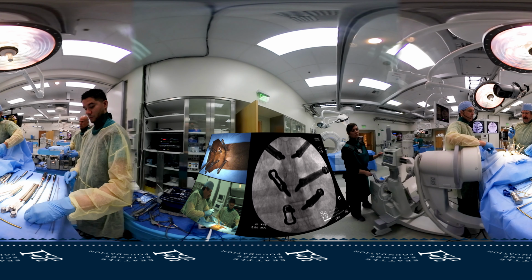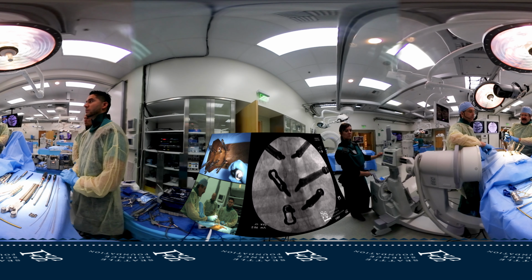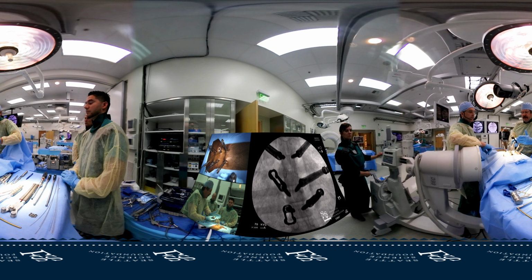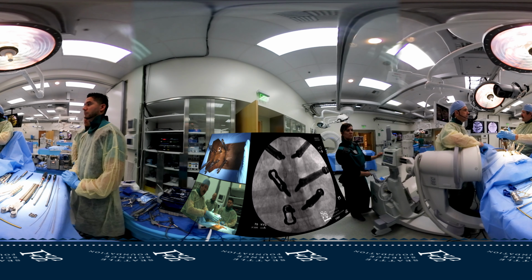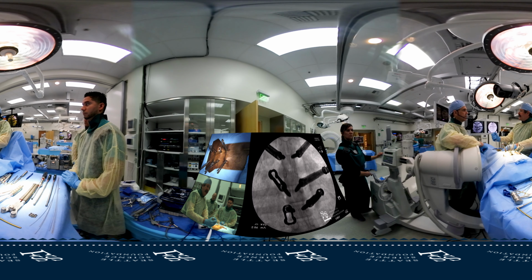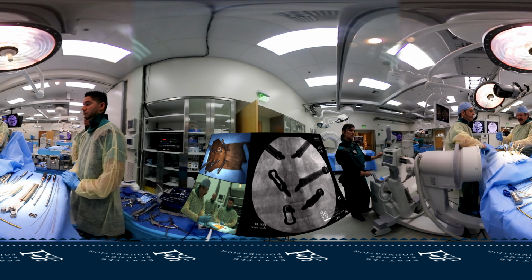Selecting rod length is also difficult because if you're in the thoracic spine, I can kind of lay my rod up against my screws and get a sense of rod length. Because these are coming out in a divergent fashion, by the time I get down to the spine, even though that looks like it matches, my rod will probably be a little long. I'm okay with that in an ankylosed spine because it doesn't move above or below. If I'm in the lumbar spine, because my screws come out convergent, if I match them at skin level, then the rod's going to be too short. And so in a thoracic spine, I'll make it a little tight, maybe look a little short on the skin. In the lumbar spine, I'll make it look a little long on the skin.